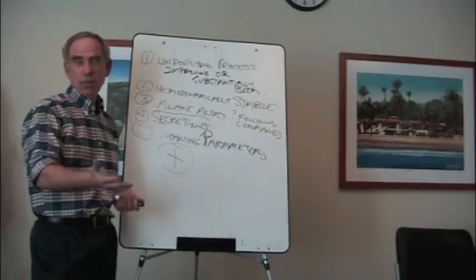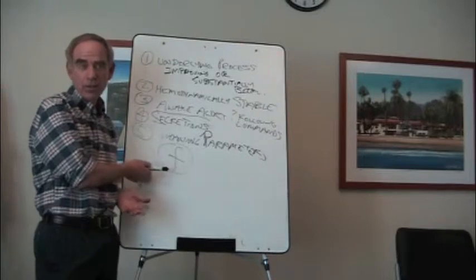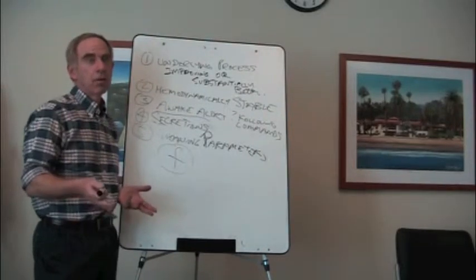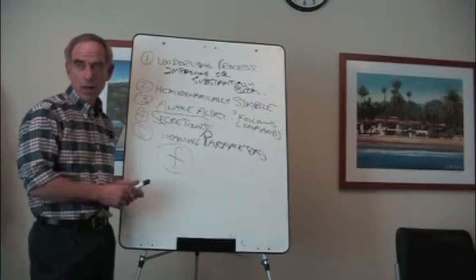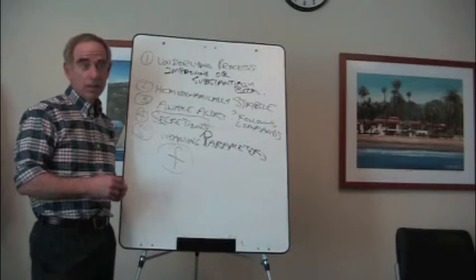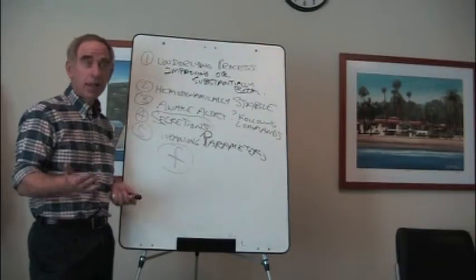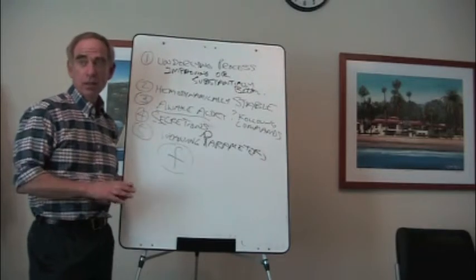So the reason why these parameters are sometimes useful, I don't use them in every patient. You've seen, we've weaned a lot, extubated a lot of patients. Have I ever asked for this in the last 3 weeks? No. Okay, when do I ask for them? Because I will ask for them sometimes. I'll ask for them when I'm having trouble weaning something, because I'm missing something here. I need to figure out, what do I need to address that I'm not addressing?